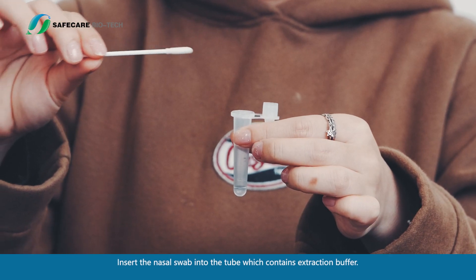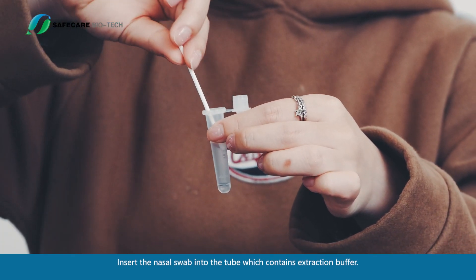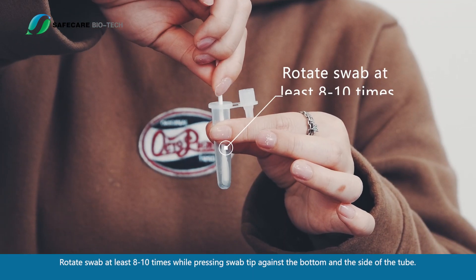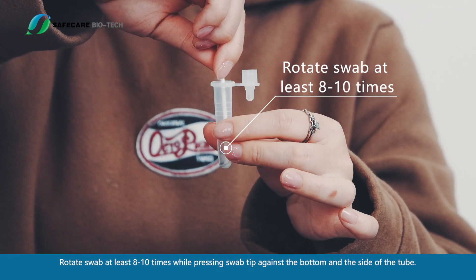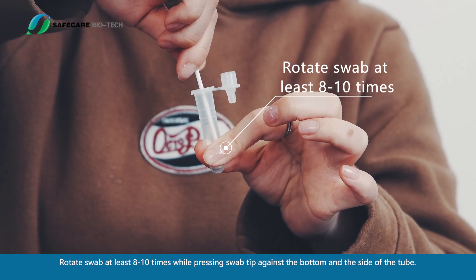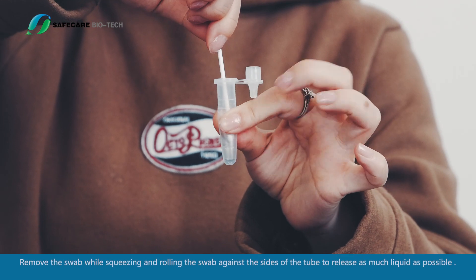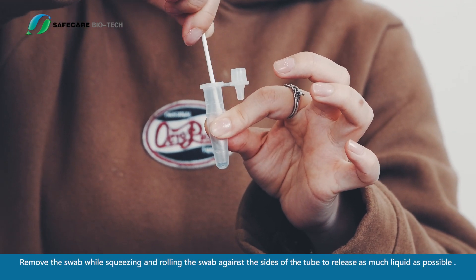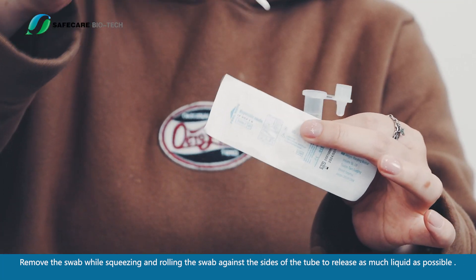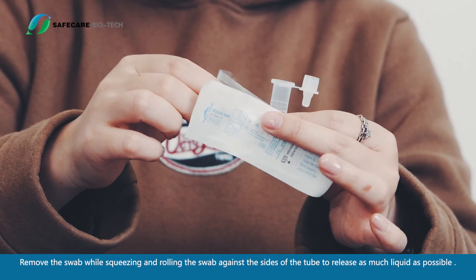Insert the nasal swab into the tube, which contains extraction buffer. Rotate the swab at least 8 to 10 times while pressing the swab tip against the bottom and the side of the tube. Remove the swab while squeezing and rolling it against the sides of the tube to release as much liquid as possible.